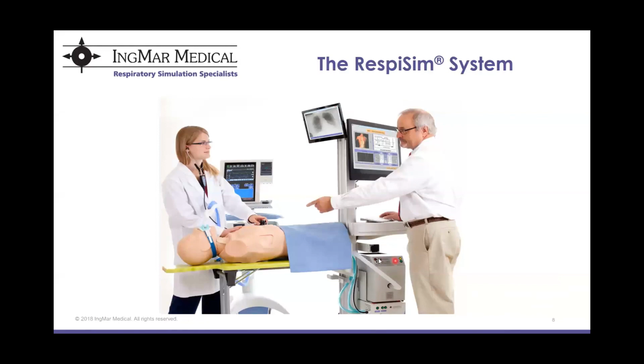Yeah, so the thing to keep in mind here is that the volume capacity is not limited when you are integrating a mannequin, because the lungs really would still be the ASL 5000, which has that 2.7 liter volume capacity. So we're not limited to the space inside of the mannequin like many other simulators.